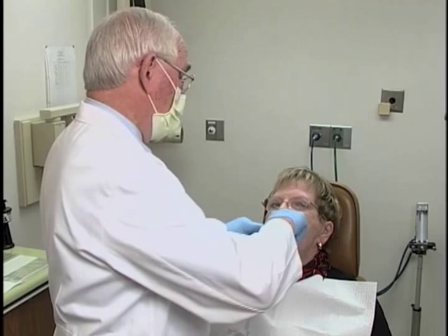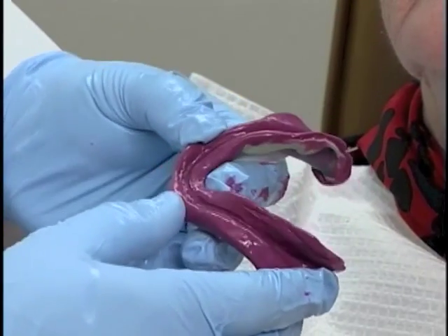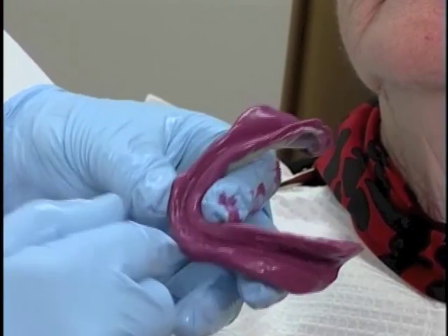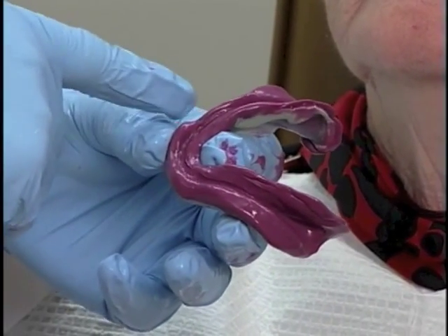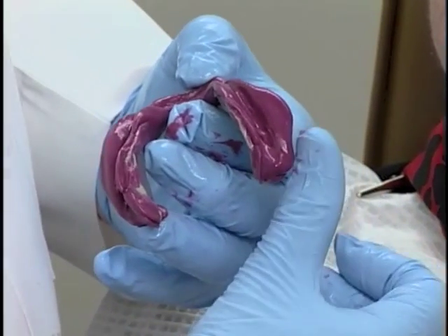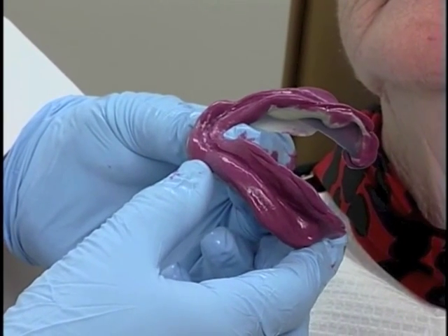Okay, now that we've made corrections on the impression, let's see what we have now. And yes, we have a very nice impression now. We have a slight little crease in the material right here, but I don't think that'll be of any consequence to us. We have beautiful peripheries on the buccal all the way around, showing our buccal notches for the buccal frena, showing nice coverage of the retromolar pads, showing the notch that the masseter muscle will make into it, and a nice periphery all the way around. So this is a very acceptable impression.